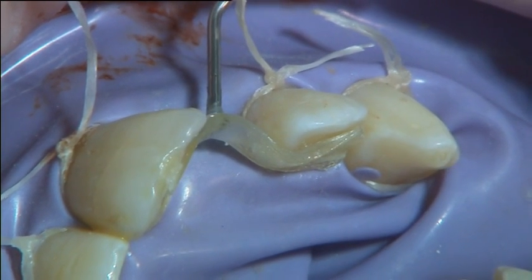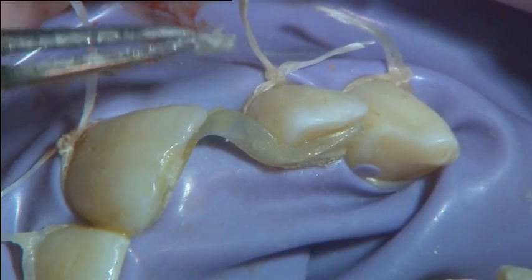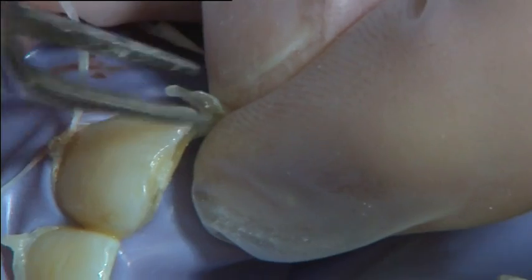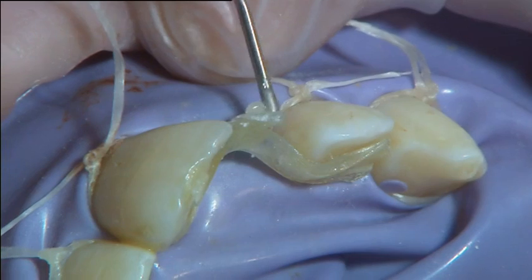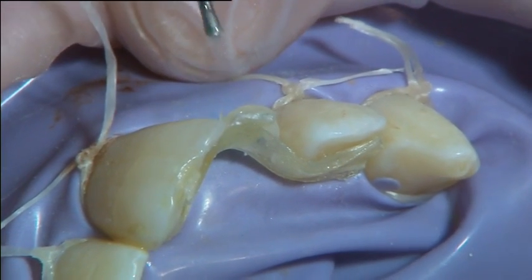The pontic area was further reinforced by attaching a short piece of fibre transversely to the main frame using flowable composite between the fibres. The pontic area was light cured for 5 seconds.